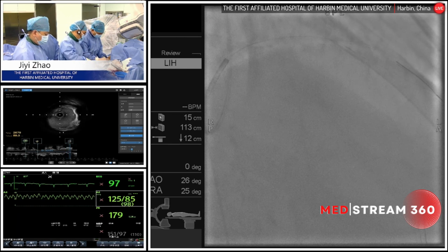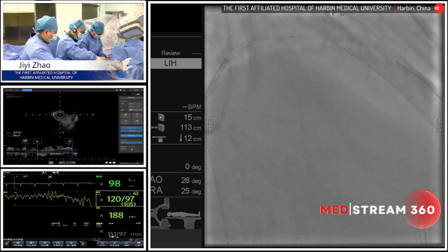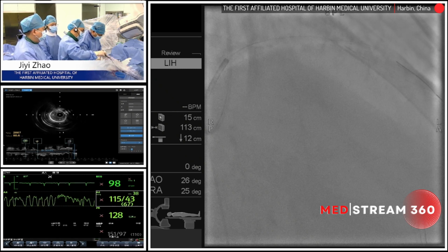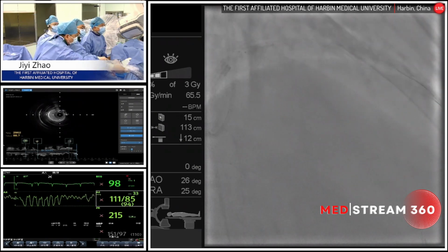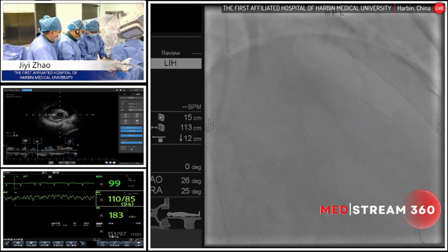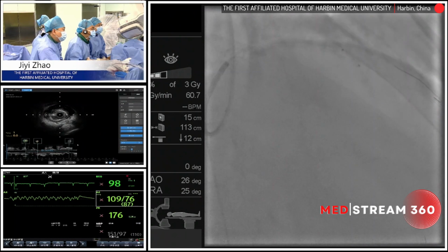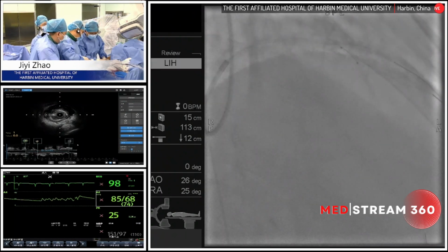So this is also troublesome, because during the rotablation operation, if some small plaque particles fall off and are flushed to the distal part of the LAD, there is a potential high risk of slow flow and no-flow phenomena. And also, if you pay closer attention, you may detect two relatively large and very important diagonal bifurcations at the severe stenosis part.